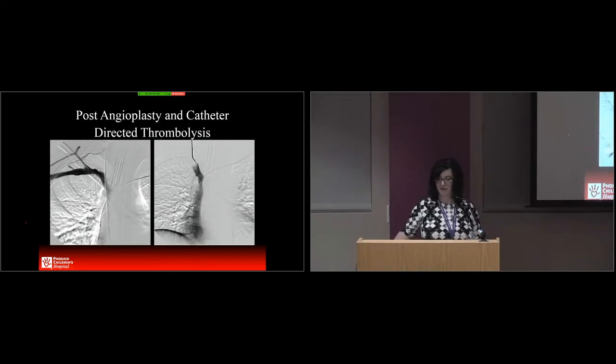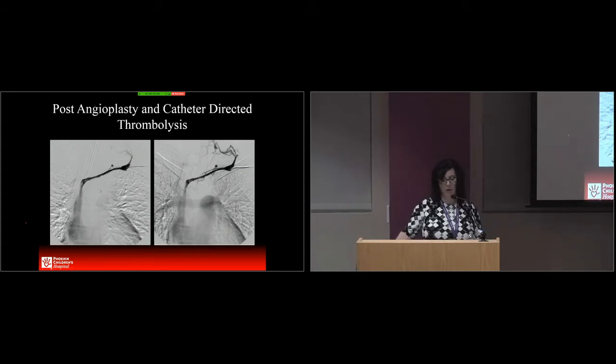And then with mechanical thrombolysis post-procedure, the thrombus is gone in the right subclavian vein. There's now patency of the right brachiocephalic vein as well. You can see that there's persistent narrowing of the superior vena cava at this level. And the catheter tip, remember, was really high. It was very high in the SVC. We weren't able to open up the left brachiocephalic vein all the way, but the lumen that is patent was the size of the catheter that was in place. But you can see that there's now flow to the superior vena cava.